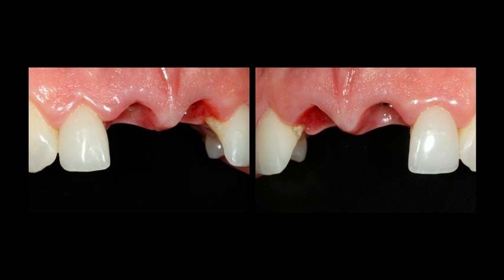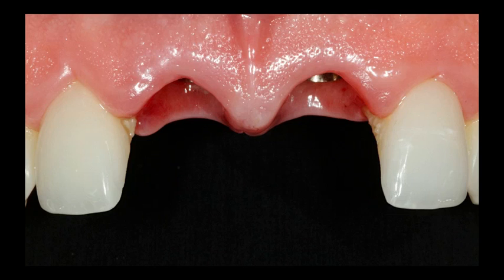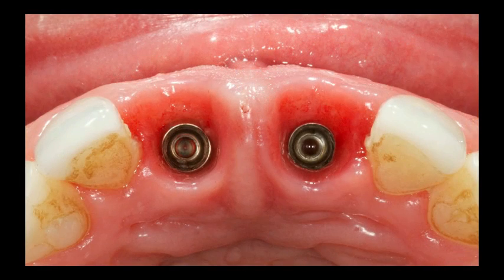I'm going to take the implant provisionals, which were splinted together, and cut them into two so that he could floss between the two implant crowns, between the central incisors, and we can push on the tissue a little bit, because right now the tissue has kind of a blunted appearance, and I want it to have more of a triangular peaked appearance. So what we'll do is we'll basically change the contours of the provisional crowns to push on this tissue subgingivally to change the shape.